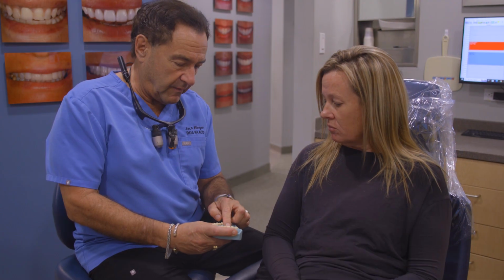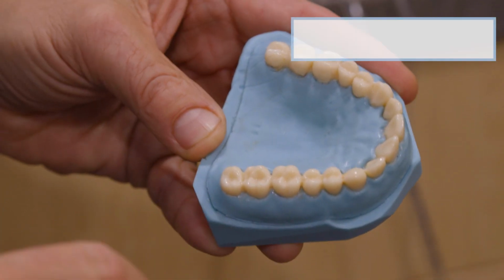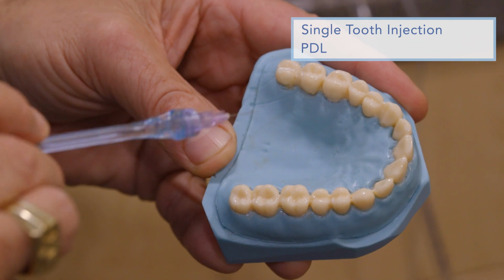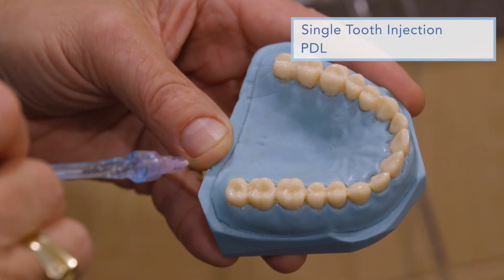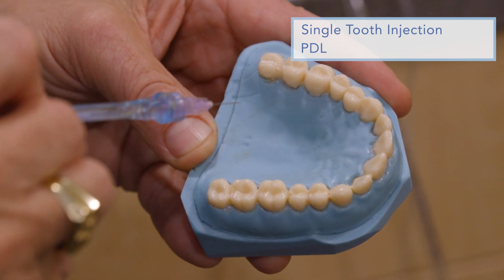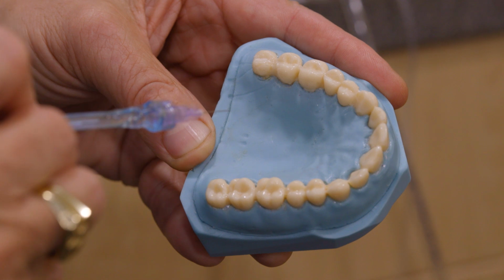coverage crowns. And we're going to anesthetize her using two different anesthetic approaches. For the lower molar, this will be a PDL injection, periodontal ligament injection, which is a controlled injection because the STA wand delivers the anesthetic at 1 drop every 2 seconds, which is below the threshold of pain.